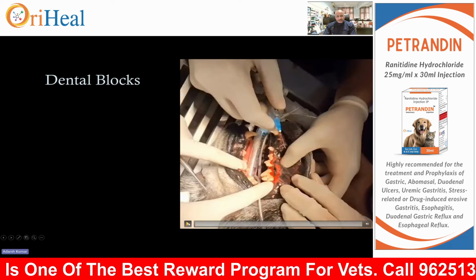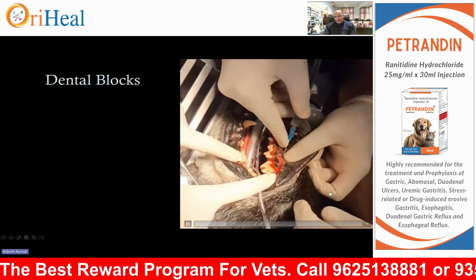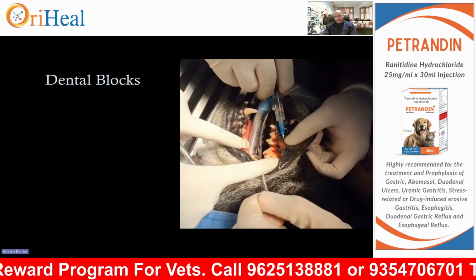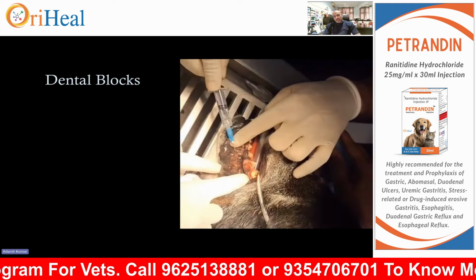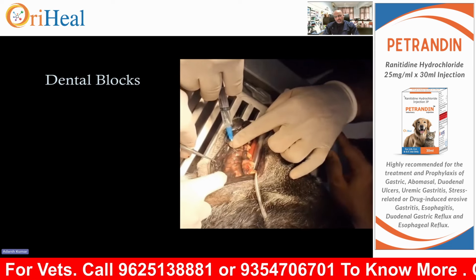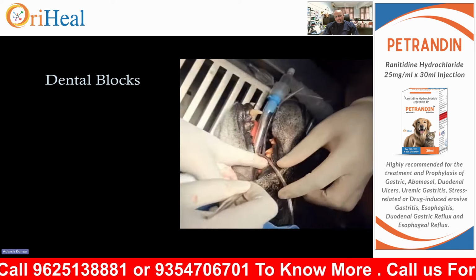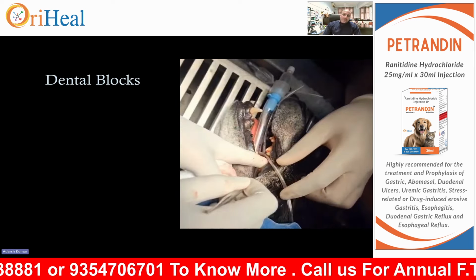So this is a dental nerve block. Again, in fast forward motion, this is the infraorbital block, some 0.5 to 0.7 ml. This is the mental nerve block, right? Mental foramen. Okay, and that's the palatine here, just caudal to the last molar on the upper jaw.